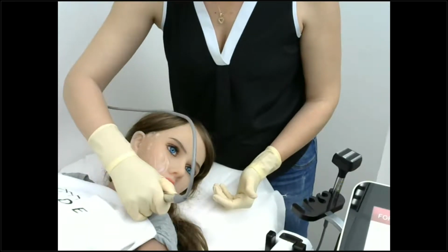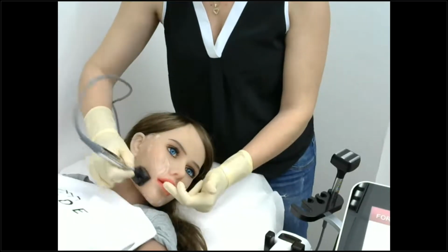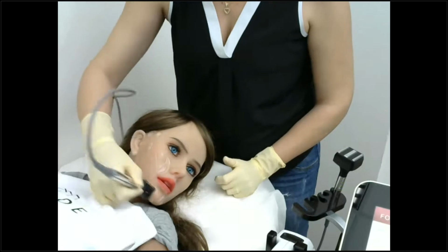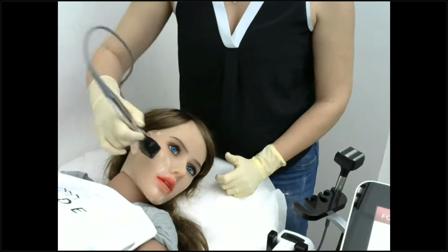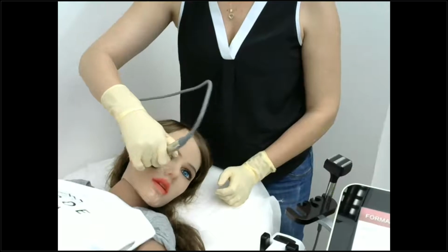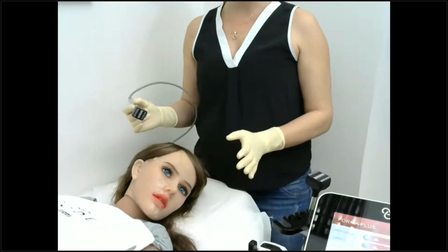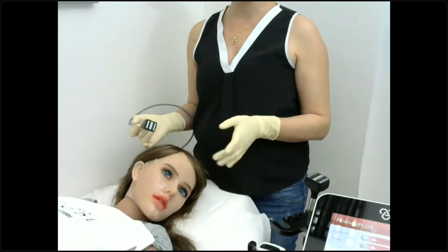Areas to watch when you're treating the face are, first of all, the chin on this treatment zone. As I said, I will give at least 10 minutes per zone. So 10 minutes here, 10 minutes there. On zone 1, focus on chin, make sure not to lose contact. Zone 2, the zygomatic arch, is the problematic area. You want to make sure that you keep it perpendicular and slightly pressing against the skin in order to keep full contact.